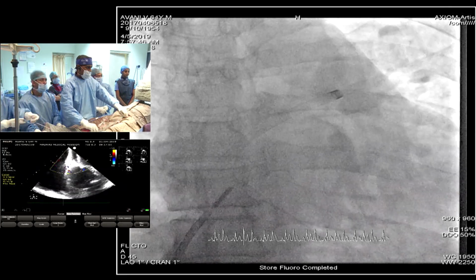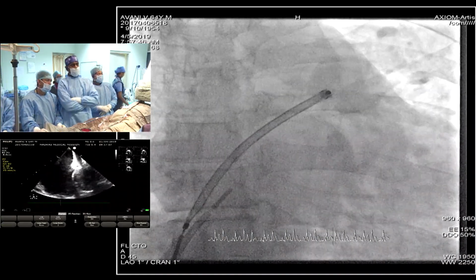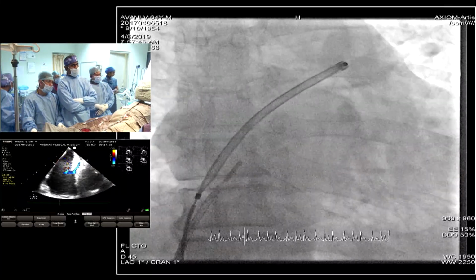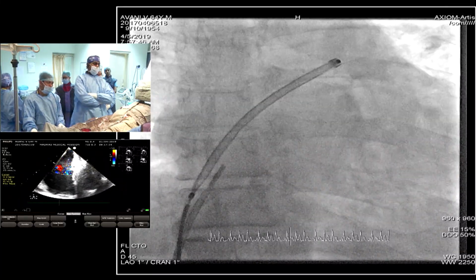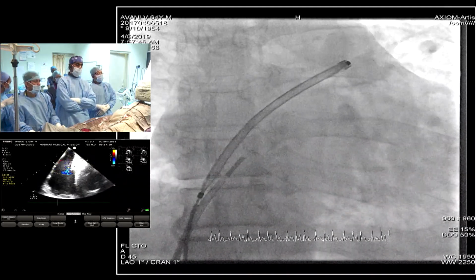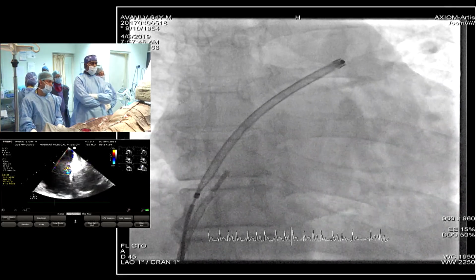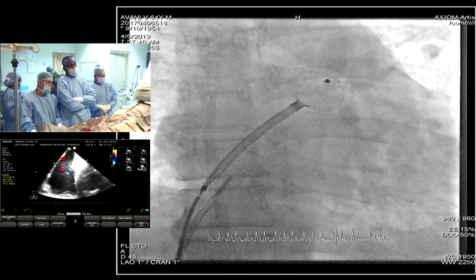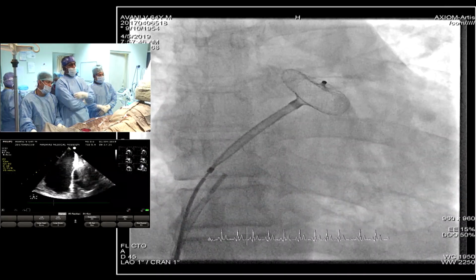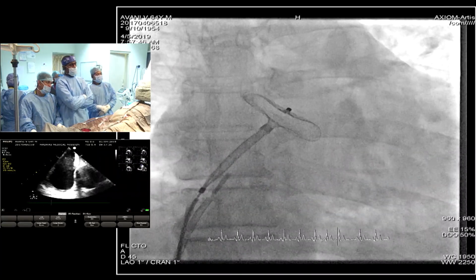Do you think there is any role for balloon sizing anymore? We don't balloon size a standard atrial septal defect at all. We use balloon sizing for patent foramen ovale in order to understand the length of the tunnel and also to find out whether it is too stretchable. We use balloon sizing whenever we are going to be using multiple ASD devices in multiple holes. Like if there are 2 holes and we are going to be using 2 devices, we independently interrogate each one. The purpose is to ensure that we are not crossing 2 sheaths with the same guide wire.